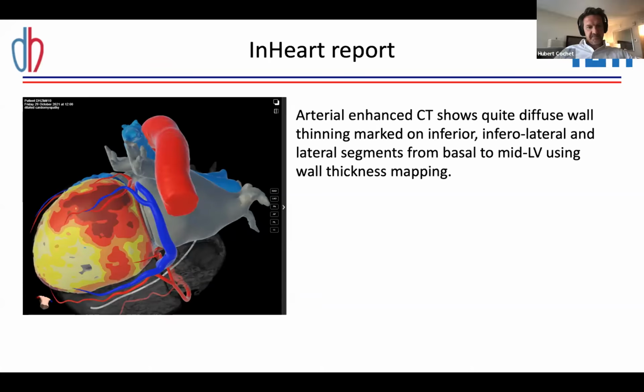Makes sense. Thanks. So, Florian, we've had a question come in from the audience, and the question is, there are not really precise CT channels with the EAM in this case. Maybe using another voltage scale in CARTO?